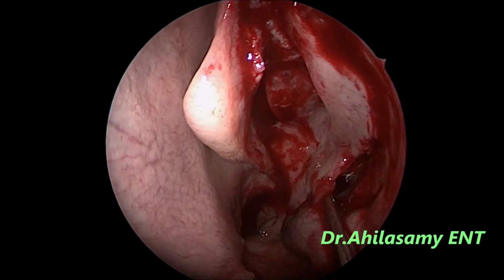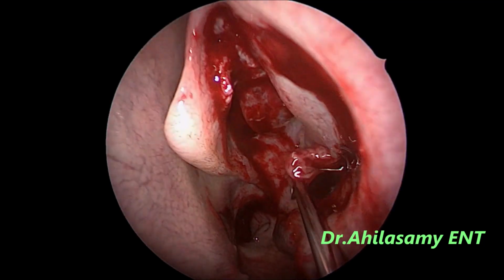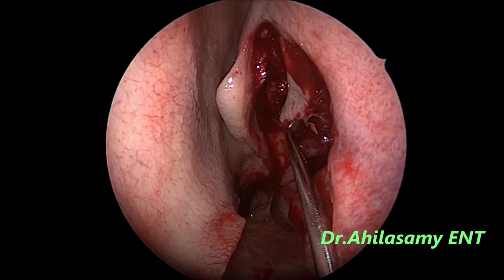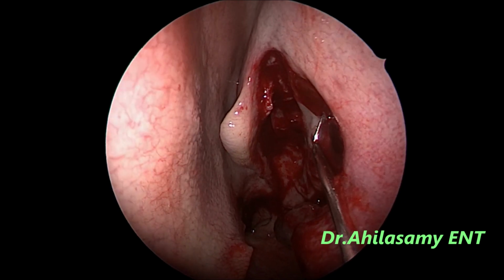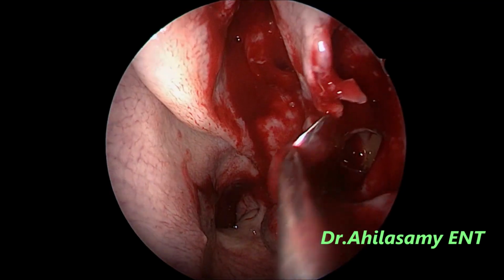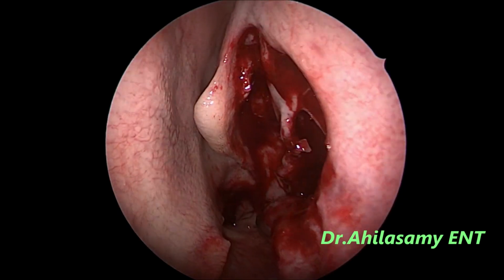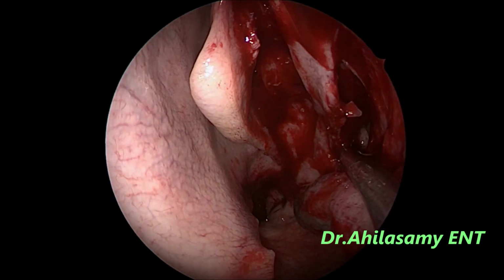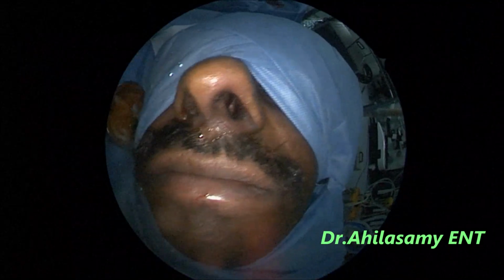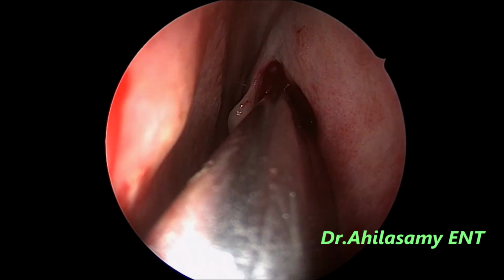I am using a Storz camera and a Storz 0-degree telescope. Later, I will be switching to the Storz 70-degree telescope for maxillary and frontal work. There's the dissector beautifully dissecting the uncinate, and already we have entered the maxillary sinus. You can have a good look at the maxillary sinus too. Please watch these videos on a big screen. Do not watch on mobile. Please pair it with a big screen of your TV or an infotainment system in your house.